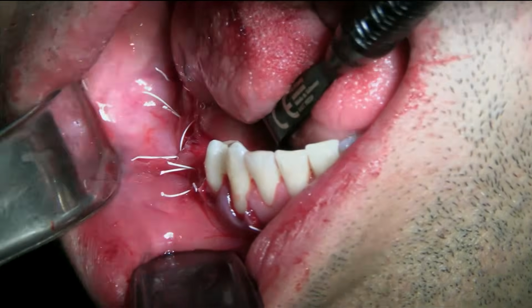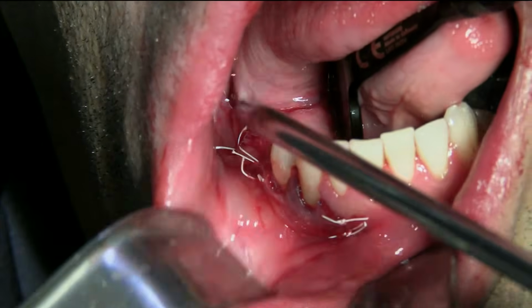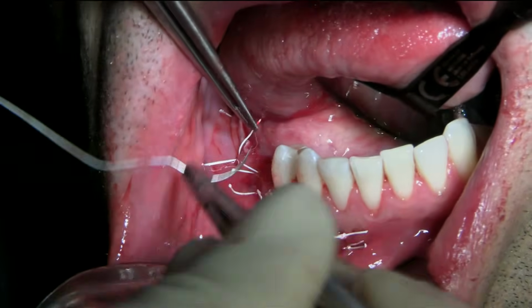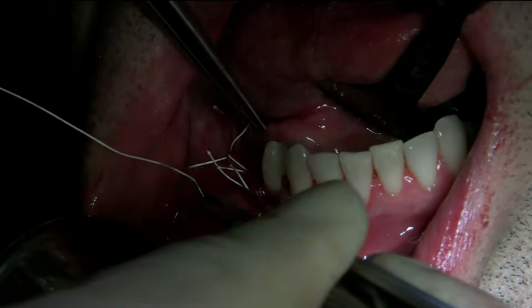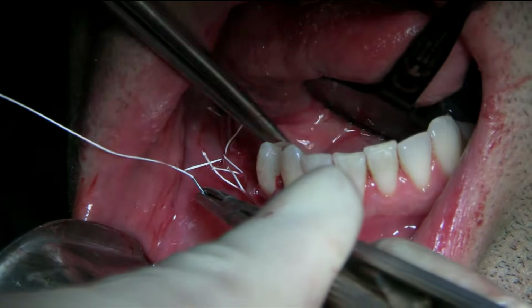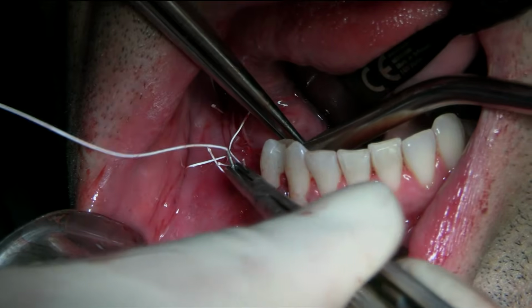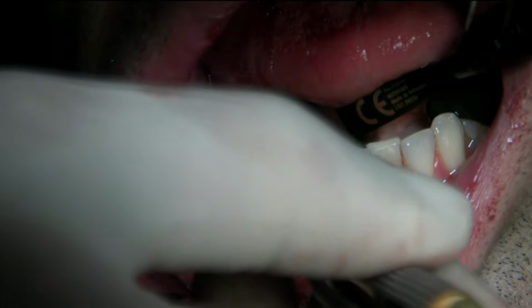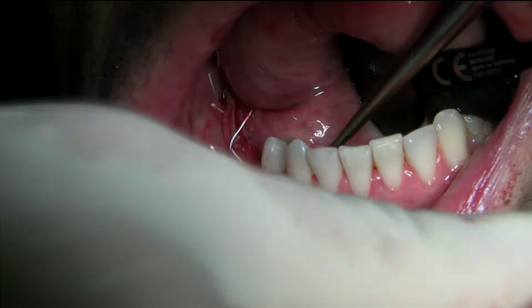Okay, I need to go anterior. I'm not going to go just distal of the tooth. Give me some suction here. Can't see the lingual. Is it grabbing the flap?